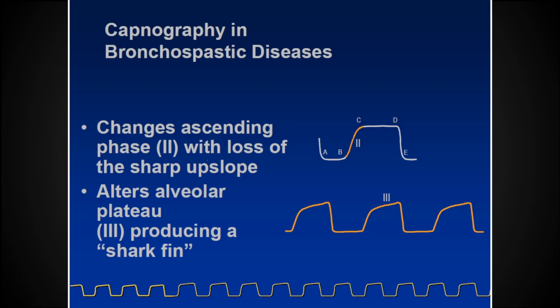Pulmonary edema won't do this, because pulmonary edema, as much as it is interrupting the diffusion of oxygen, CO2 can travel pretty freely through it. It will not look like this because it's not restricting the movement of the CO2.